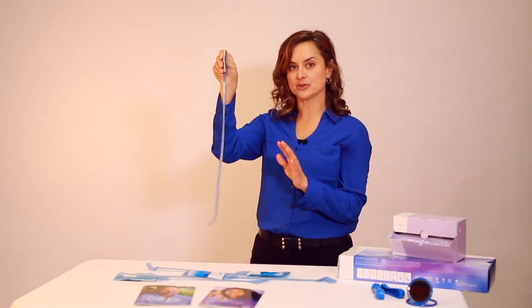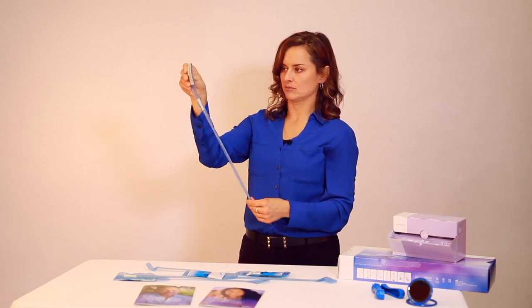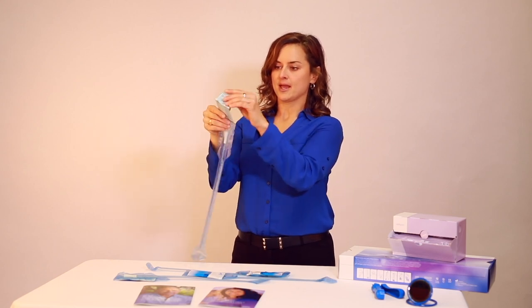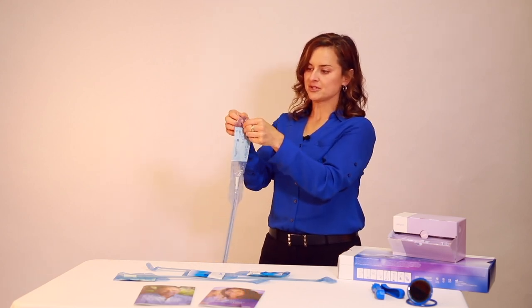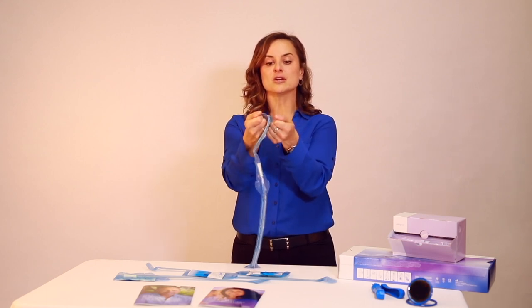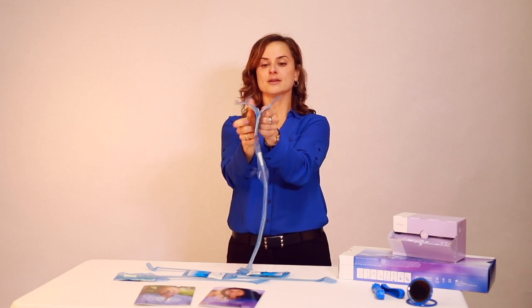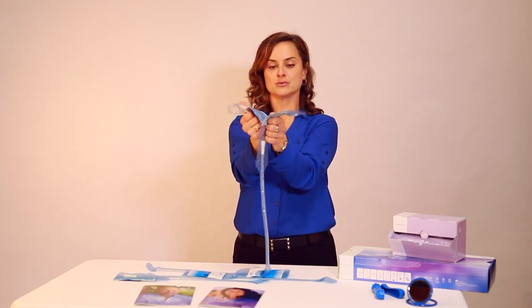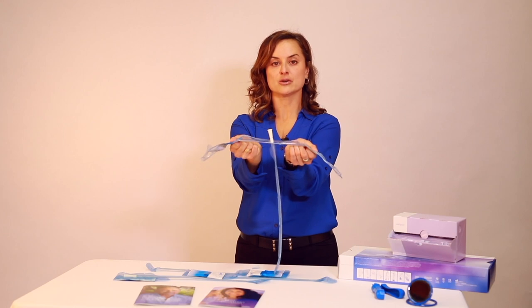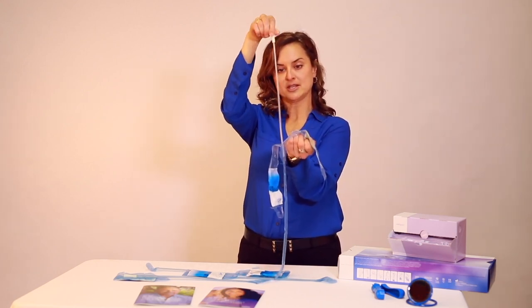The Lofric Primo has a 30-second soak time. After the Lofric Primo has soaked for 30 seconds, and when using the peel-down method, you'll simply put your fingers through the finger loops at the top and peel the package away, continuing to peel down until the Lofric Primo is exposed. Then you can reach in, pull it out, and use it.